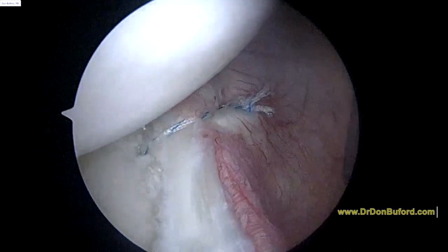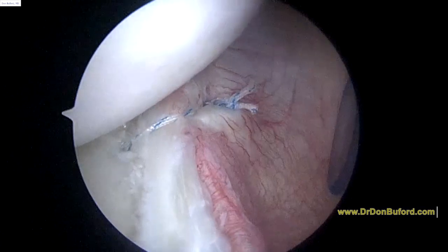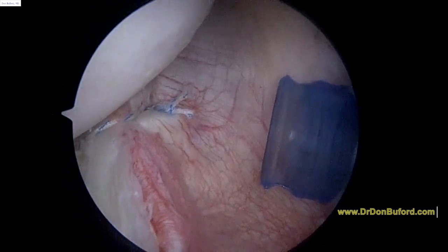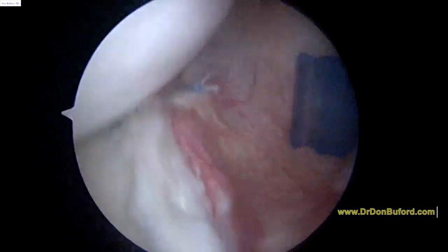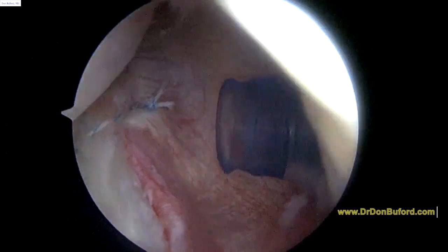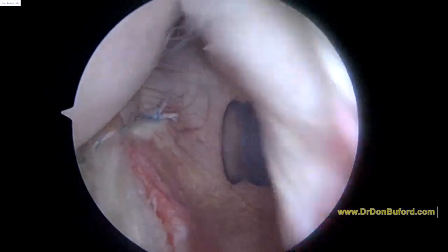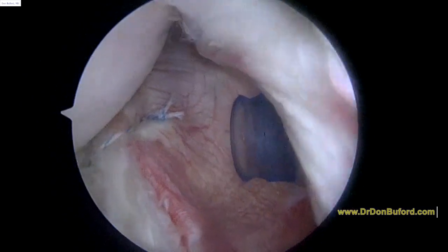The first stitch, that looks great. You can see how that's really snug down that posterior corner, which is exactly what we wanted it to do. And what we're going to do now, a little bit of luck, is pass another anchor. So I'm just trying to get a guide back in position again. So it looks like we're coming through right about there, which is where I want.